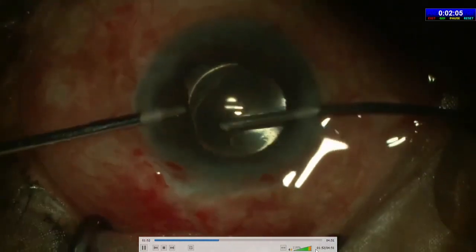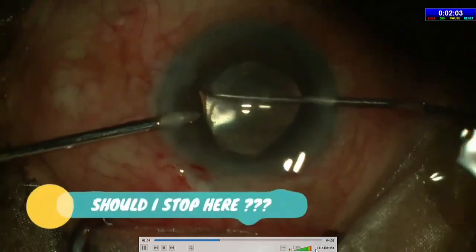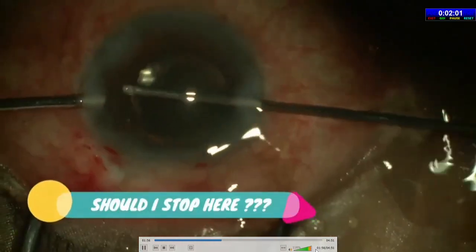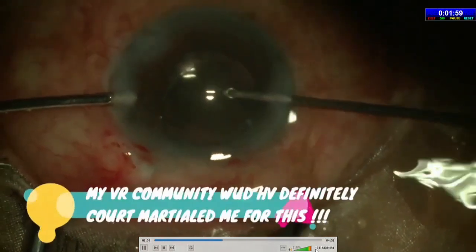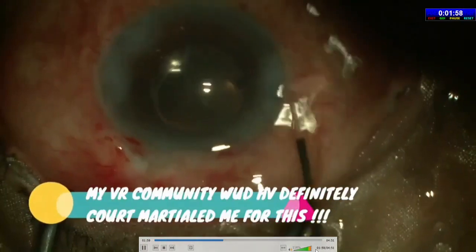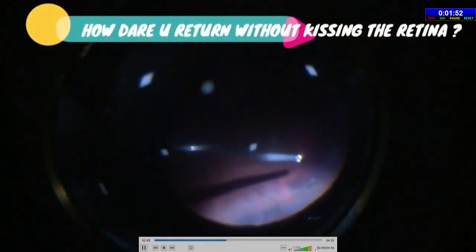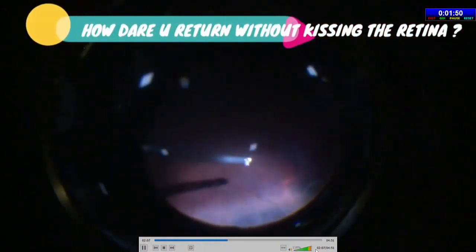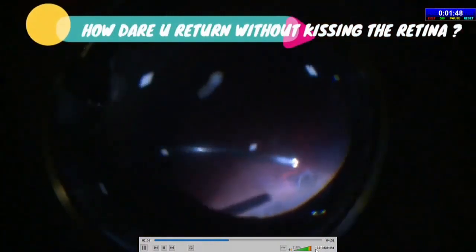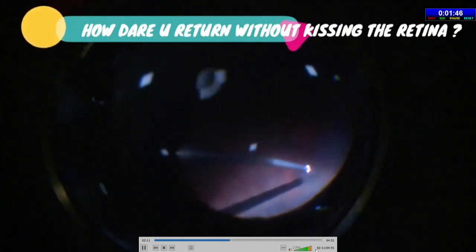Following final cutting of vitreous strands going to the wound, I decided to do a total pars plana vitrectomy, despite being sure there would be no lens matter in the vitreous, as lens matter had never left the bag. The vitreous was clean — no doubt — but note the evolution of a retinal tear right in front of your own eyes, as a result of vitreous tug in a partially PVD eye. This would have definitely resulted in a retinal detachment later.